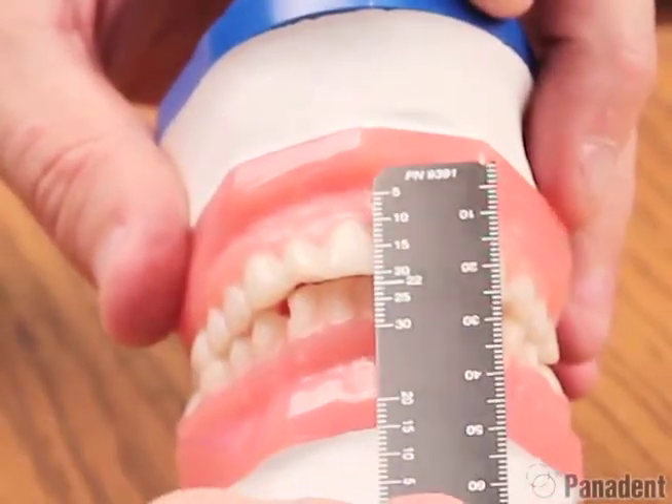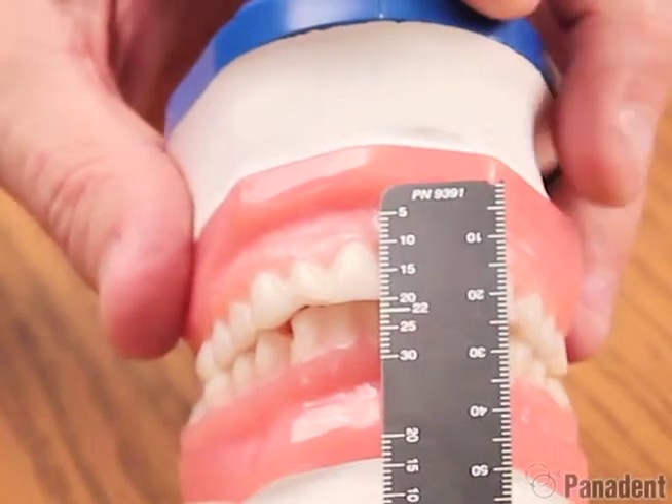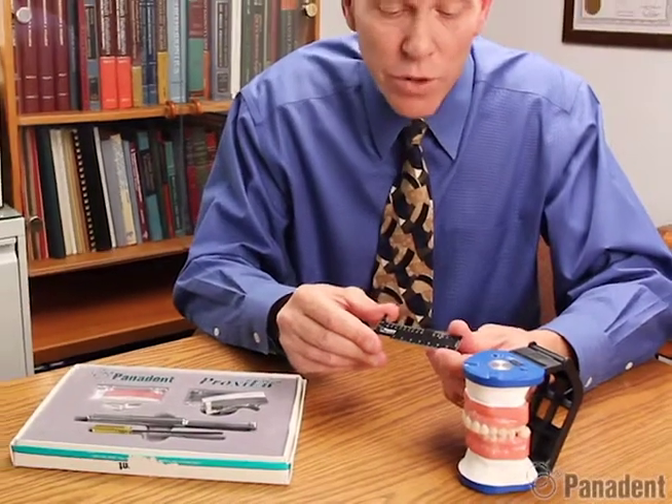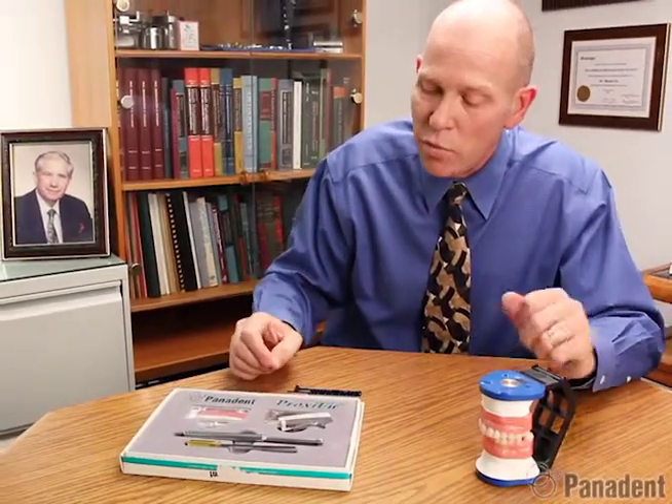It also has the frenum to incisal edge 22mm distance built into it as well. So it's a multi-measuring ruler for measuring tooth widths, tooth lengths, overbite, overjet, and range of motion. That concludes my presentation on the ProxyFit module and the multi-measuring ruler. Thank you.